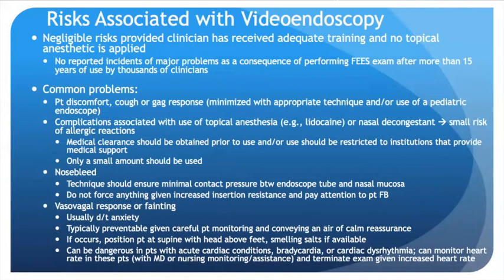There is a risk of what's referred to as a vasovagal response, or fainting, during the procedure. This usually occurs due to anxiety, and it's typically preventable given careful patient monitoring and conveying an air of calm reassurance to the patient. If this does occur, you will want to position the patient supine with their head above their feet and possibly provide smelling salts if available.